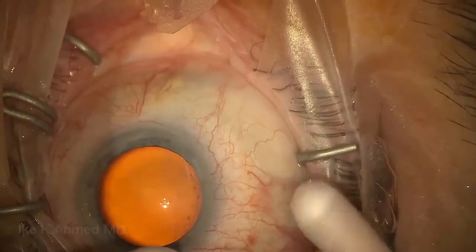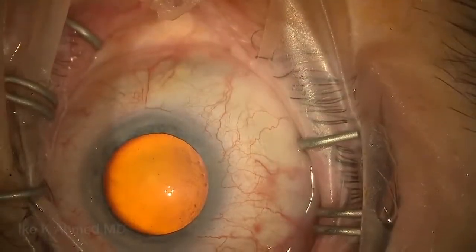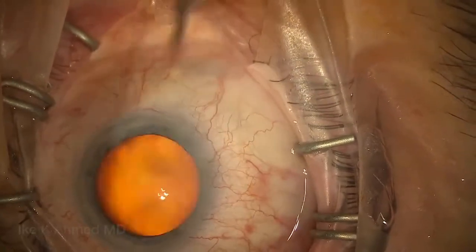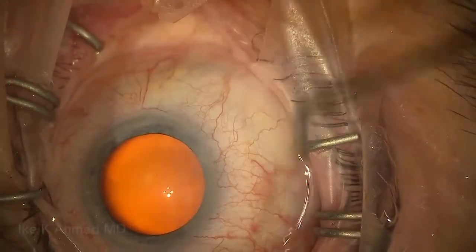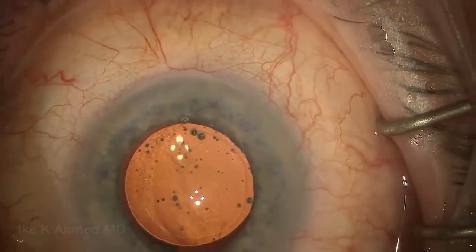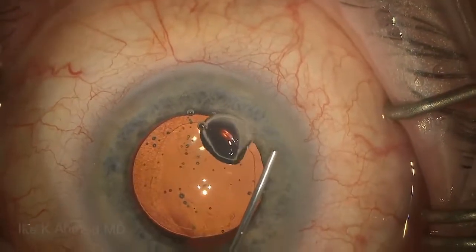Mitomycin binds fairly quickly, so there's very little concern about entering the eye, although we do irrigate the surface of the eye to ensure there's no free mitomycin that may have leaked onto the surface prior to making incisions. The main incision is made temporal in all cases, and this will be used both for the phaco as well as for the Zen implantation.